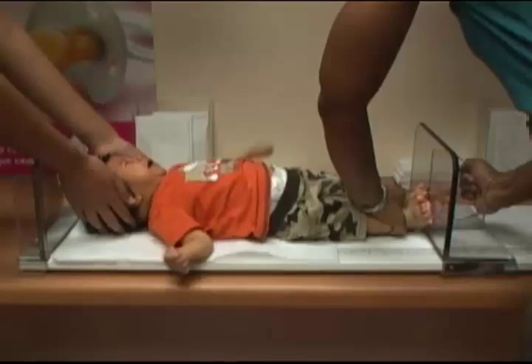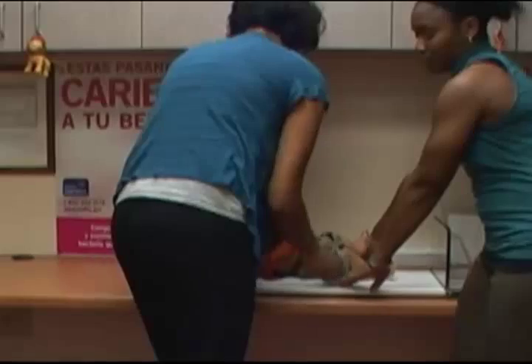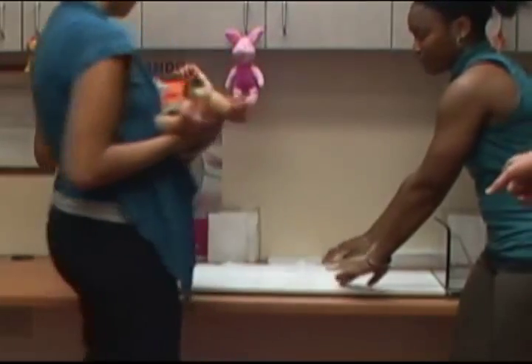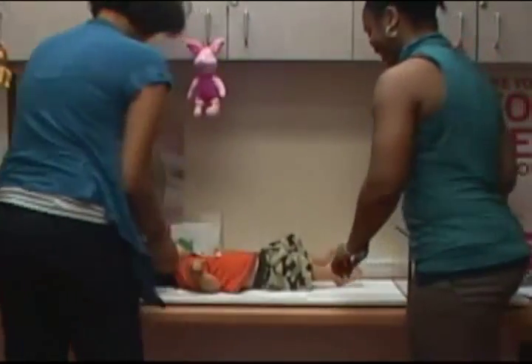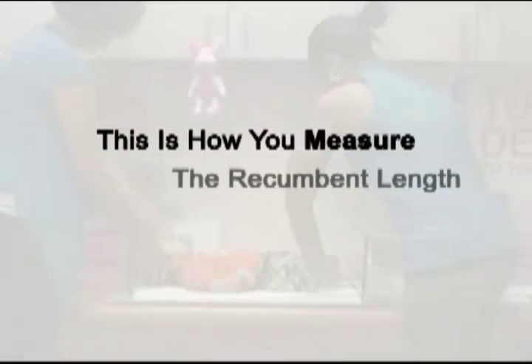Make a mental note of this measurement to the nearest one-eighth of an inch. Some children aren't comfortable in this position and they might become fussy or cry. Just keep patient and focus on getting accurate measurements. And remember, with some time and practice, you'll perfect your ability and become really good at this. This is how you measure the recumbent length of an infant.